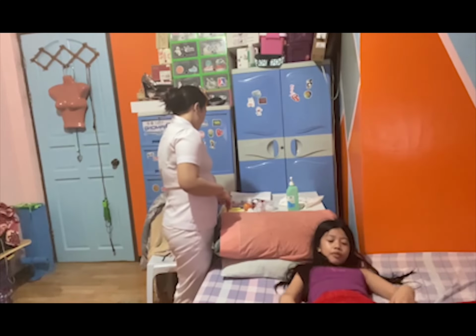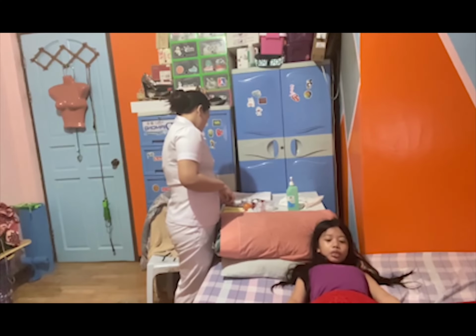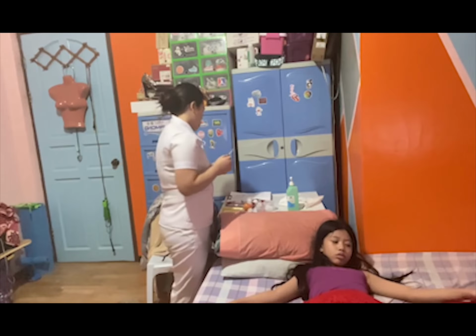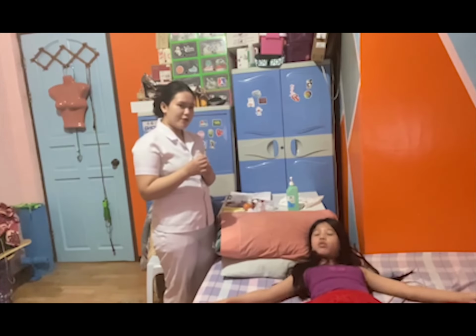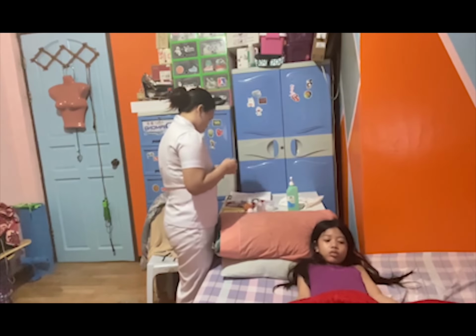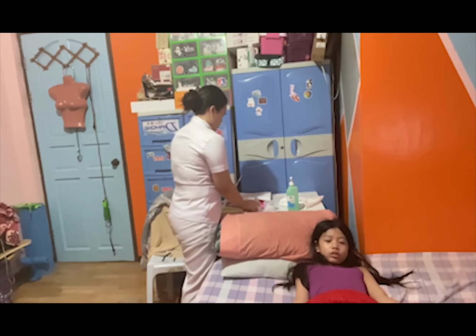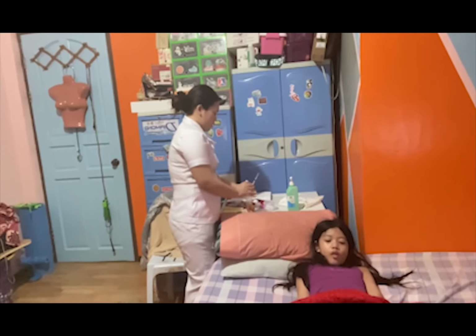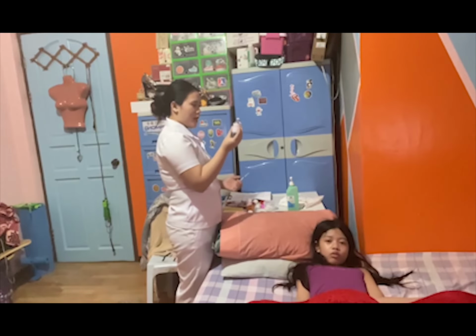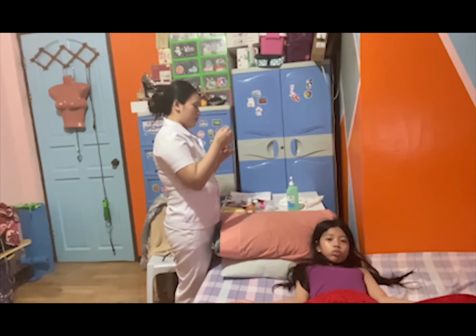Then I'm using the 1 ml syringe with a gauge of 25. Then gently shake the medication bottle. Then remove the cap.